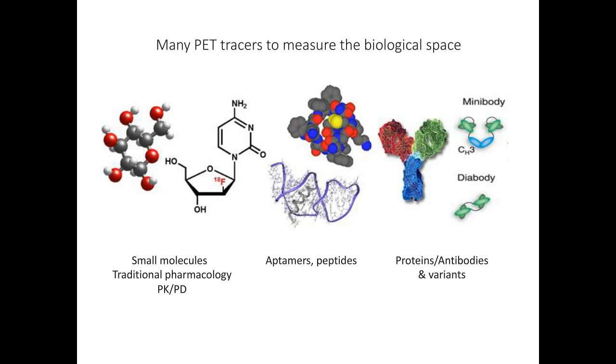So the biological space is pretty large in terms of what PET imaging can allow us to see, depending on the tracers that we radio label.